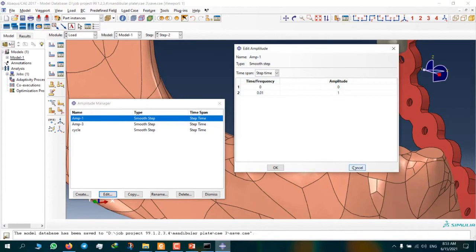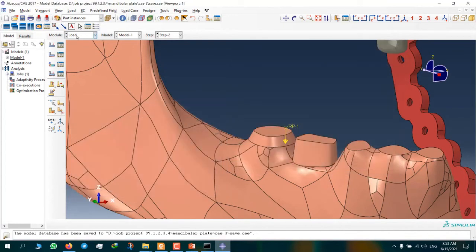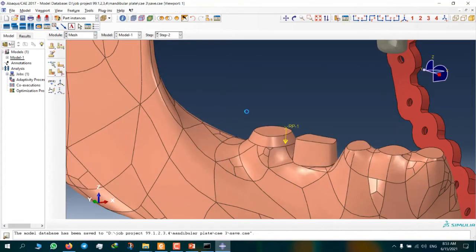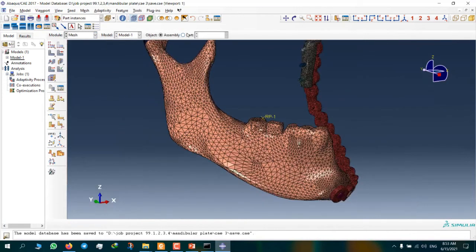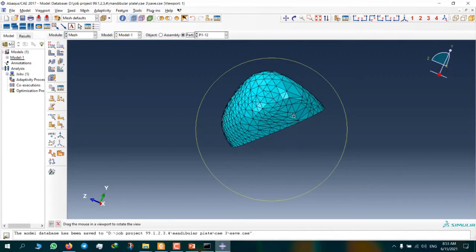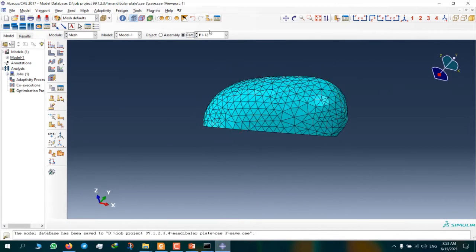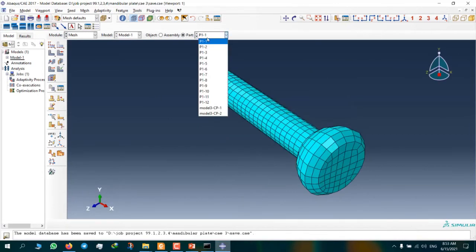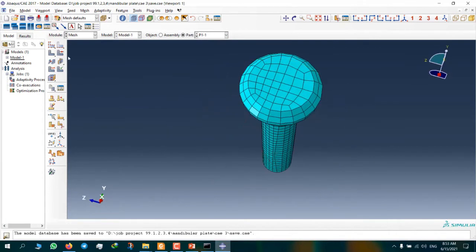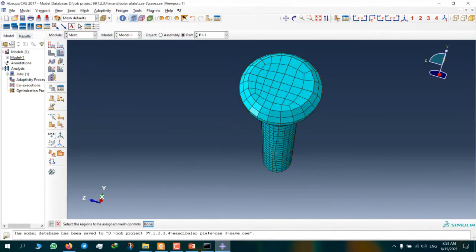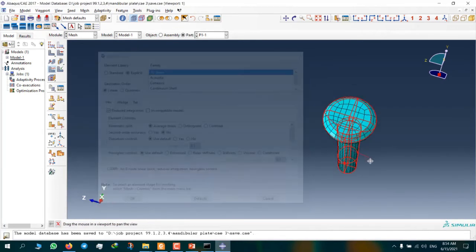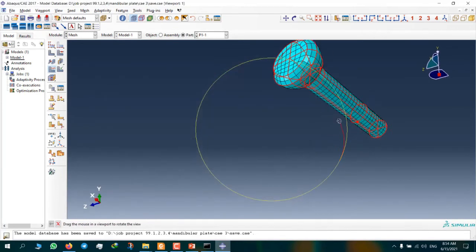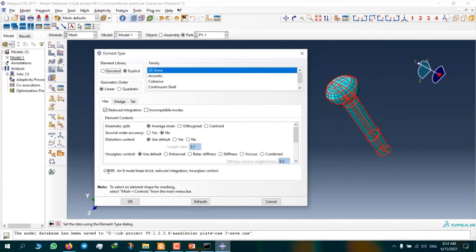Now for the mesh module, we can use two types of elements. We can use hex mesh. You can see this is hex mesh, C3D8R element for a screw.